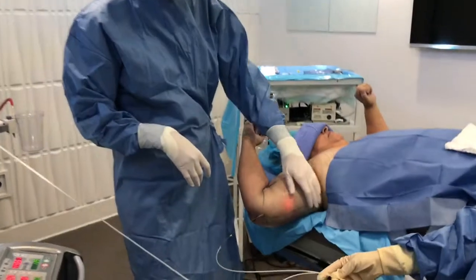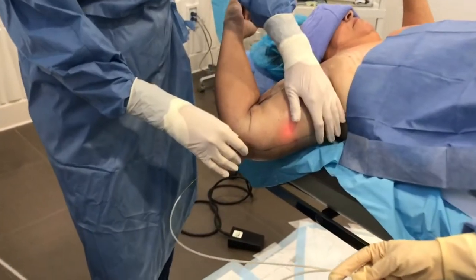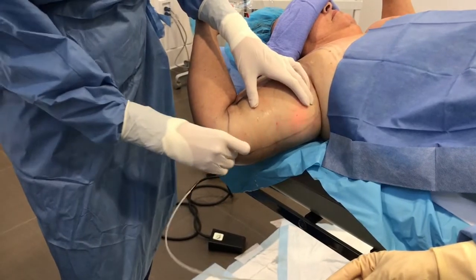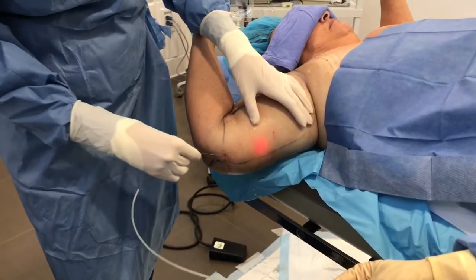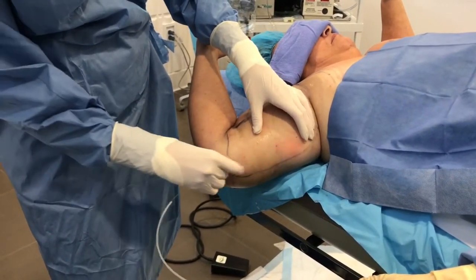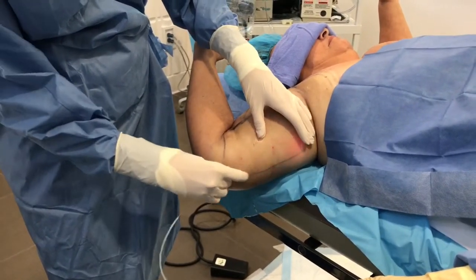I just wanted to show a little bit of treatment of this inferior arm area where we're actually trying to tighten up some of the skin. We've numbed up the patient with tumescent anesthesia, and I'm using a bare fiber to just gently work through this, and there's very little resistance to the tissue as I'm actually treating.